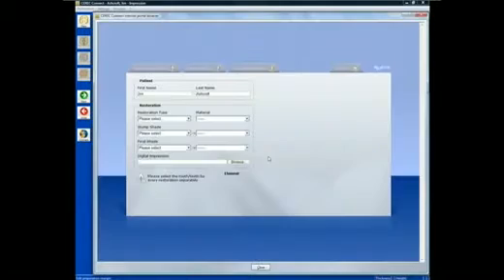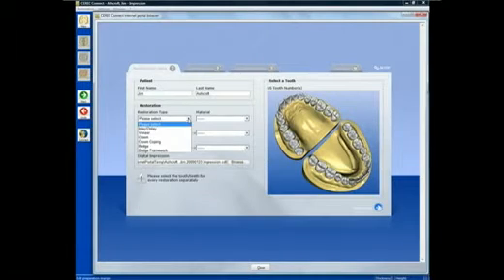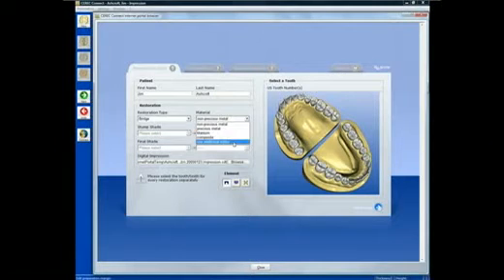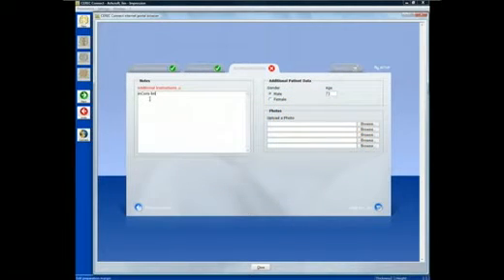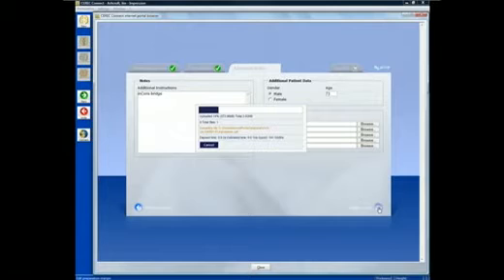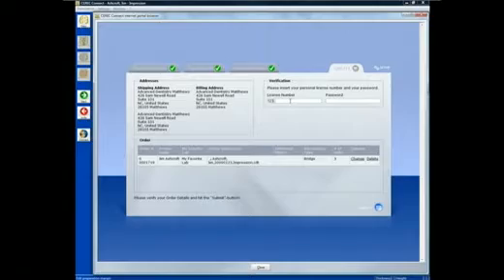An online prescription form is filled out with the patient's age, teeth numbers, indication, material type, preparation shade, and desired restoration shade. Once the prescription data is entered, you can add additional information or extraoral photos, and then select the lab that you want to use, along with the desired return date and even time, and then add the prescription to the cart. For final submission to the laboratory, you will have to electronically sign the prescription with your license number and password.